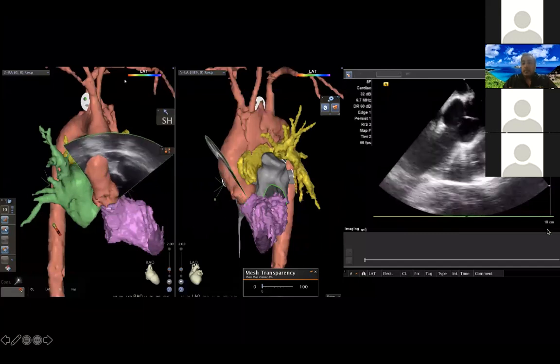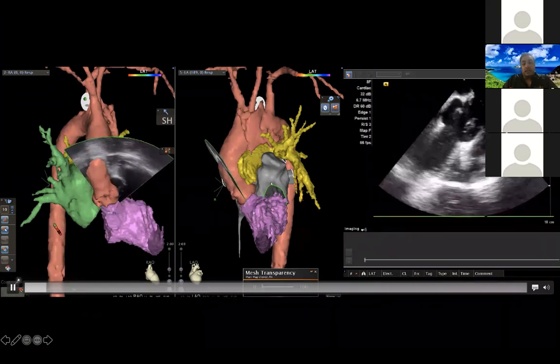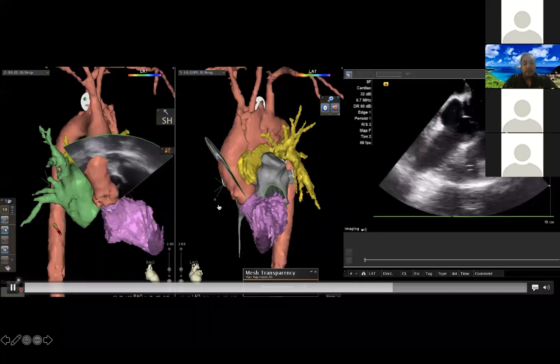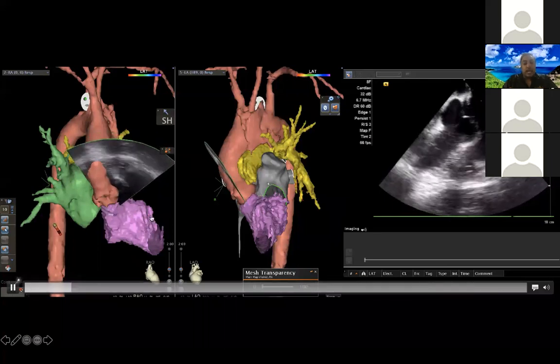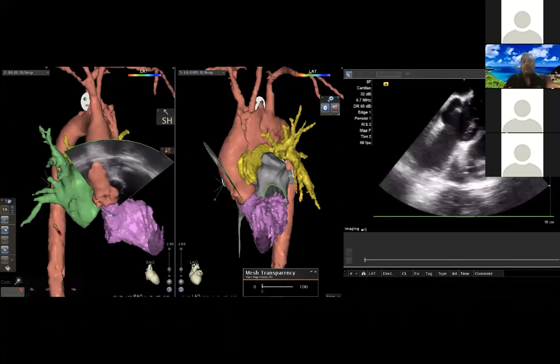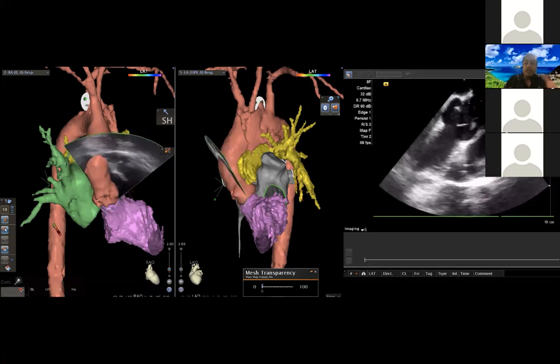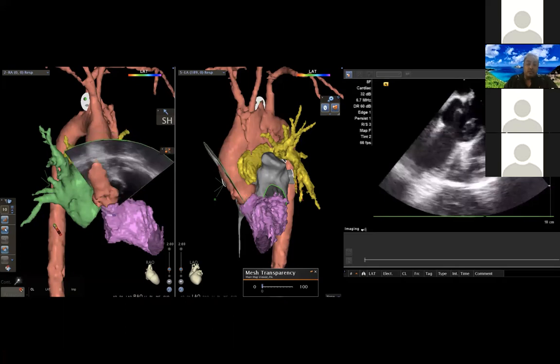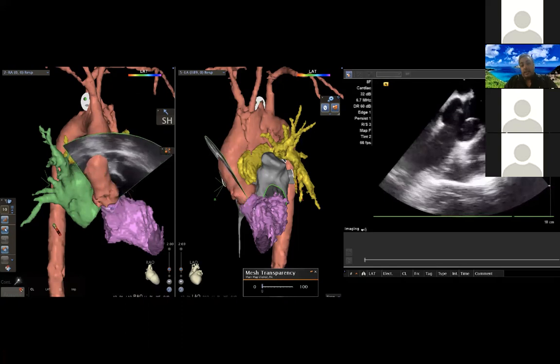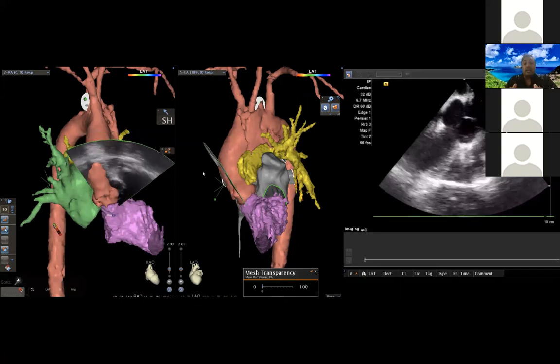Okay, so this is just a point that I want to make about ICE. What I've done here is I've taken a CT that we used pre-ablation from several years ago, and I've merged it with my left atrial anatomy. The point that I want to make is that, number one, I think many fellows coming out of training now are probably extremely capable with ICE. When I came out of training, my ICE skills were really quite rudimentary. So I suspect this is old hat to many of you, but I'll reiterate that the best way to become comfortable with ICE is to use ICE. You just got to use ICE.